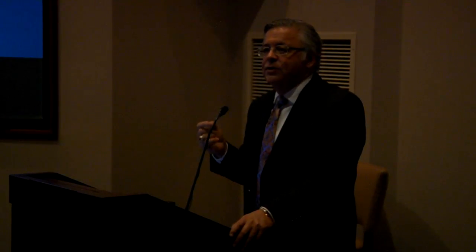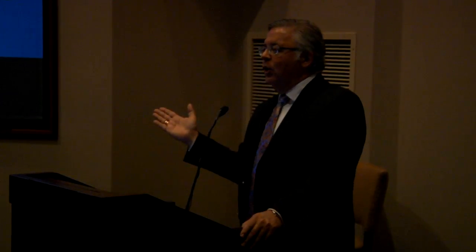I showed you some numbers which quantitated diffusion in terms of the apparent diffusion coefficient. We do not report those numbers. The machine will generate those numbers, but at this point, in terms of clinical practice, really nobody knows how to use those diffusion-weighted numbers to generate a number that may help us to decide who are the patients that have tumor necrosis and who are the patients that still have residual disease that is viable. We do that subjectively based on interpretation of the grayscale images.